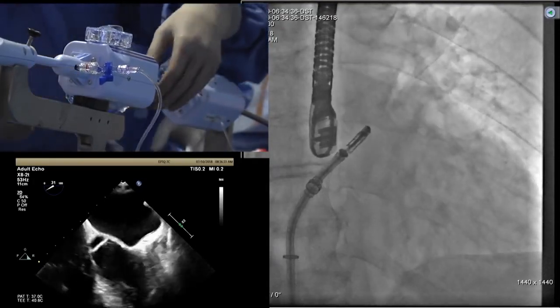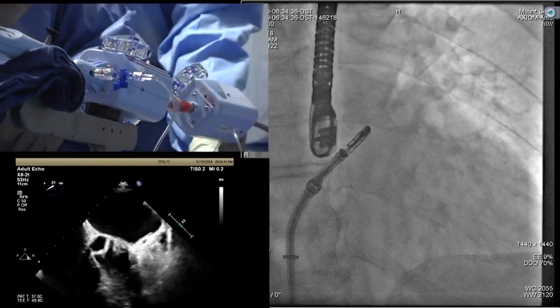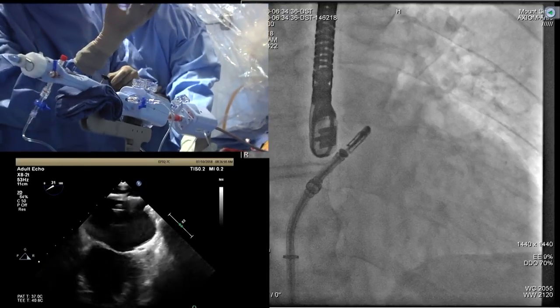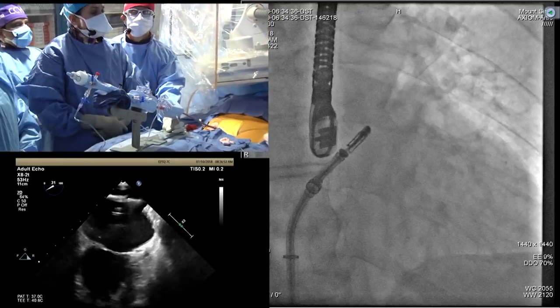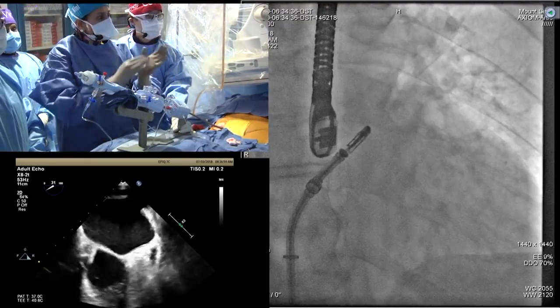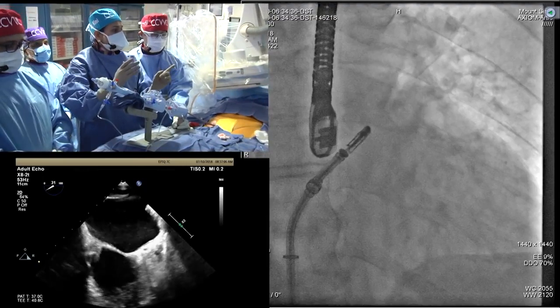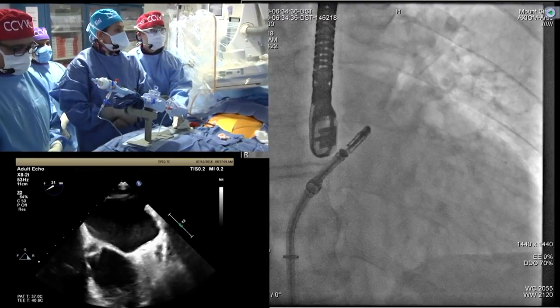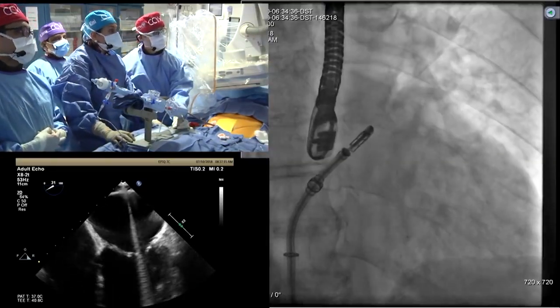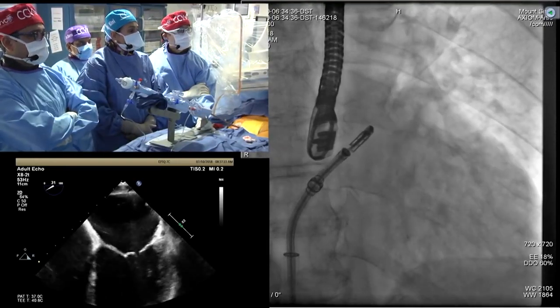It's a good straddle. Perfect. So essentially, what happened is the clip delivery system that just went in has two radiopaque rings, and then your steerable guide catheter at the tip has another ring. Got that? The steerable guide catheter ring has to be at the center of the two rings of the clip delivery system. So CDS has two rings, and then you have a steerable guide. Can we go cine? You see it now? There are two rings on either side of the ring of the guide. So this is called straddle.